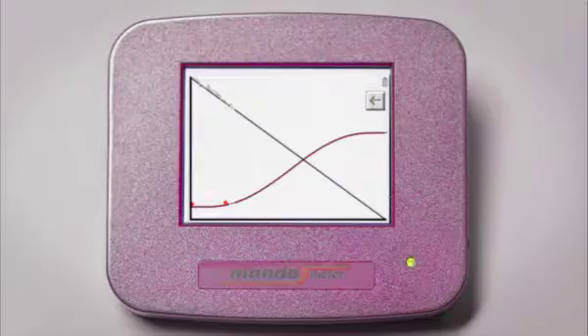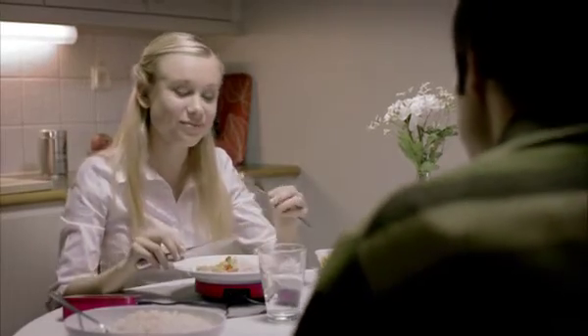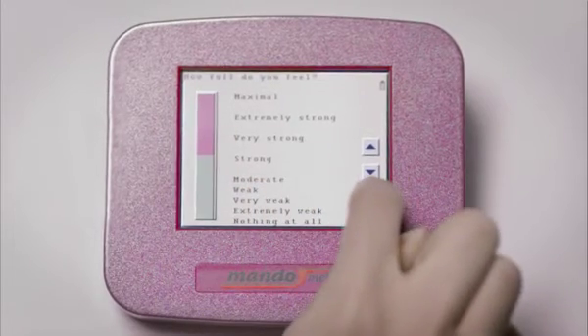When you are eating, the weight of the plate decreases. Mandometer tracks the speed you are eating at relative to what is appropriate. You are prompted to model your own rate of eating as well as your feeling of satiety against the reference curve showing normal eating patterns.